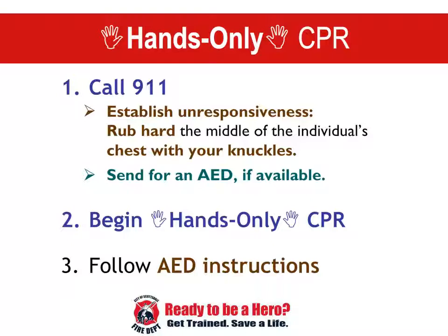The person who last did compressions will rest. The machine is moved to the side of the body so that they can listen for the AED to give instructions. The other person will begin compressions, pushing at a rate of 100 compressions per minute at a depth of 2 inches until the AED says to stop. This process will repeat every 2 minutes. The pads stay on and the machine stays on until the firefighters arrive.